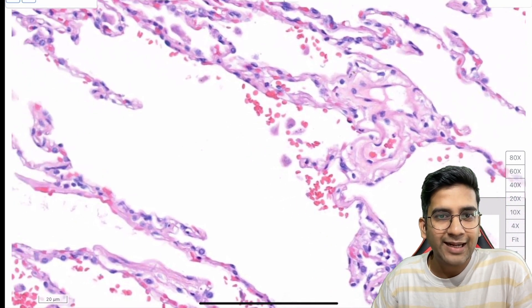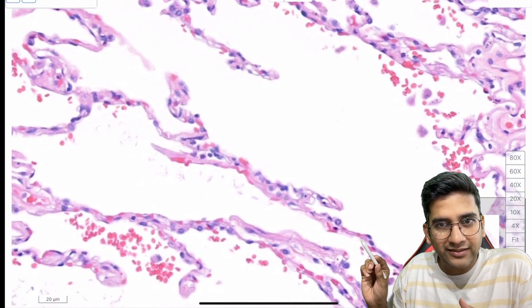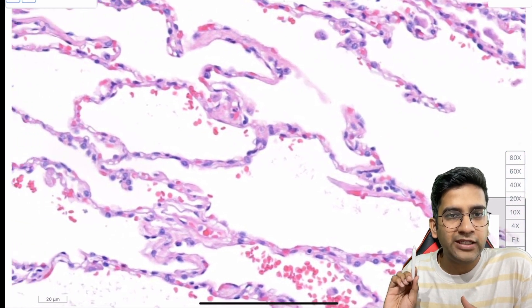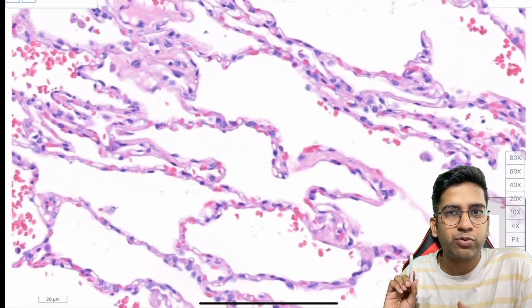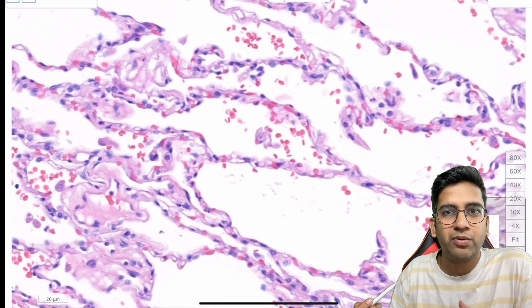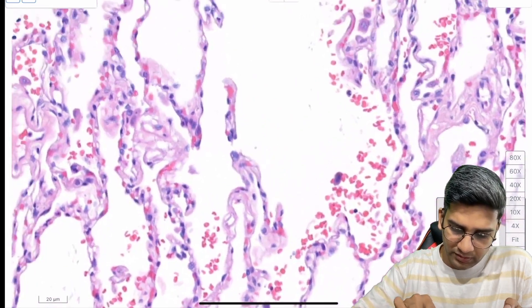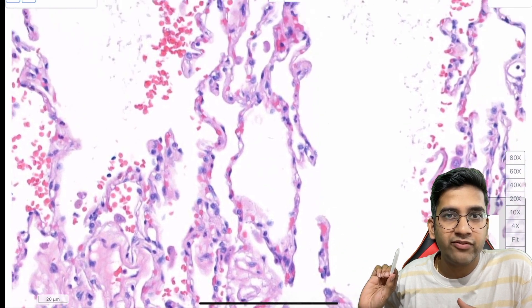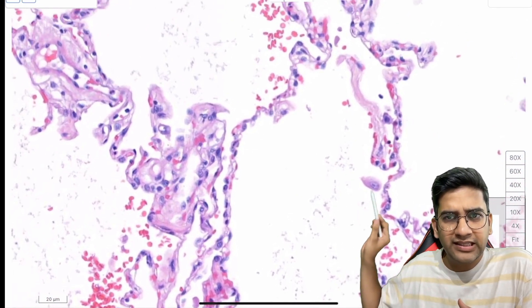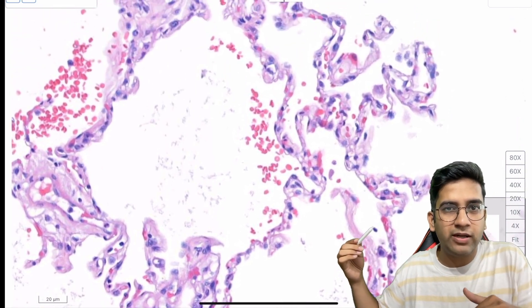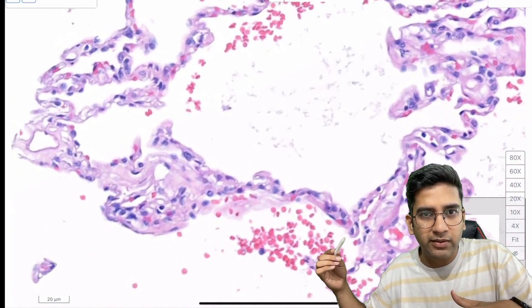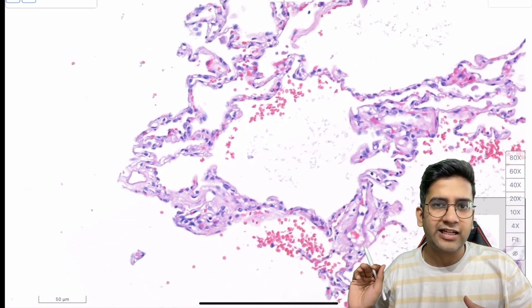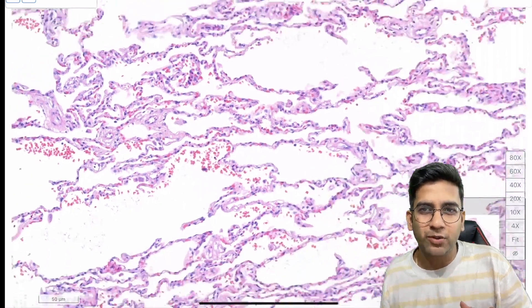The type 1 epithelium is extremely flat. For type 2, you have to search a little — it's projecting slightly, a very subtle projection. That's your type 2 epithelium with a hobnail appearance. If you see diffuse alveolar damage, the hobnail appearance will be much more prominent than in normal alveoli. Those round cells inside the alveolar spaces are pulmonary alveolar macrophages — quite common. There may be some RBCs due to post-mortem trauma in the biopsy.